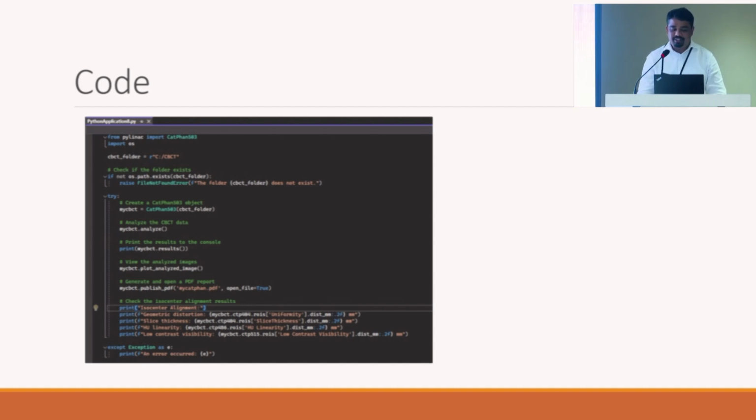The first line is just you bringing your Pylinac library in. The second line is just you telling it where your DICOM data are. And the third line is just you telling it to analyze the images. That's it. Then you can print the data in a PDF, or you can assign the tolerance. You can change the tolerance according to the baseline of your data. So these are the 4 lines you have to write.